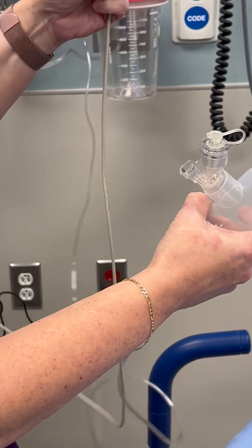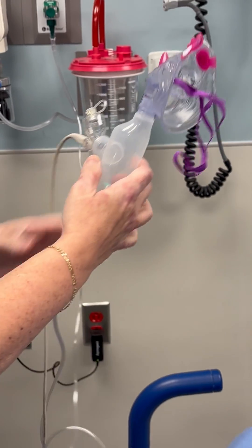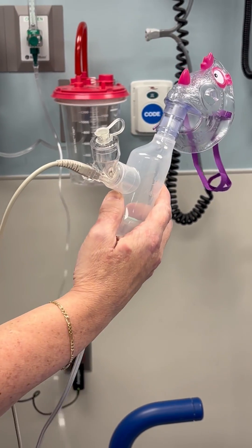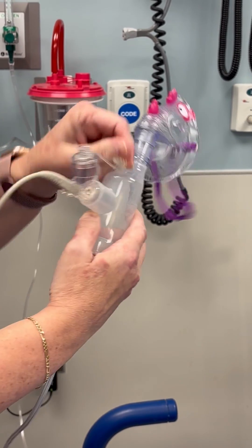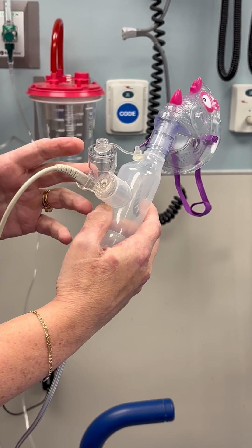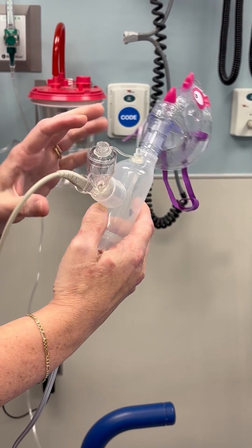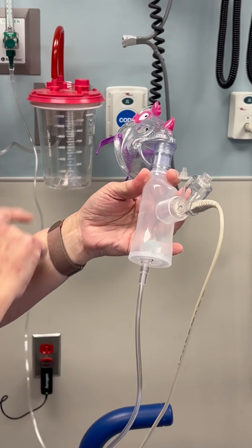We're going to put this right in there. Now we're set up and we just have to have the medicine. The medicine is going to go into this little chamber. When we turn it on, this is going to cause that breakup — it's going to create a mist, a very fine mist. It's all going to be contained in this chamber until there's inhalation.